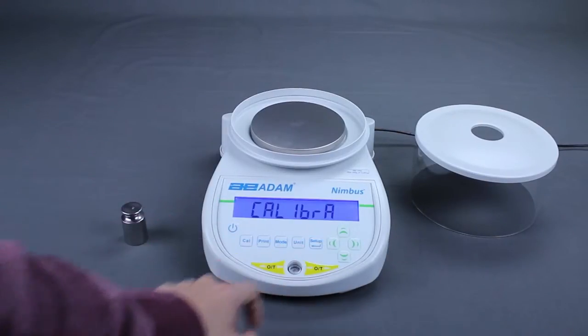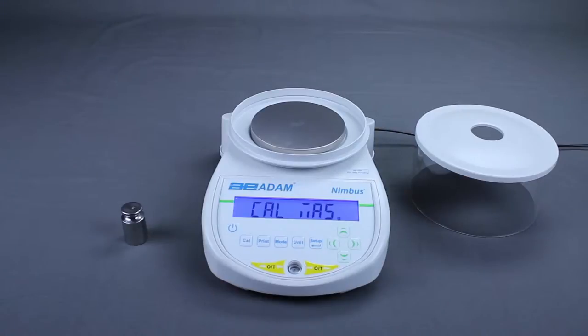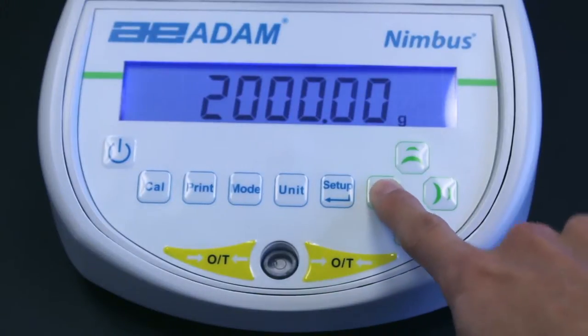Press Setup Enter to continue. The display will show the required calibration mass for your balance.